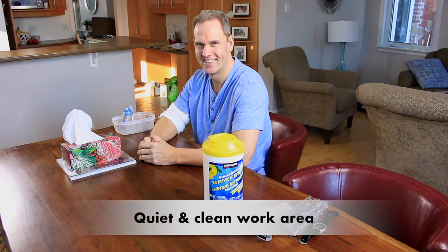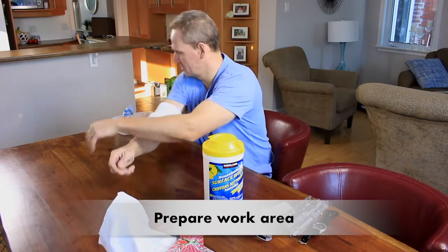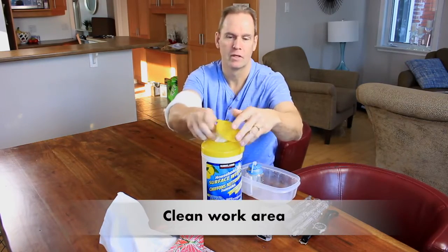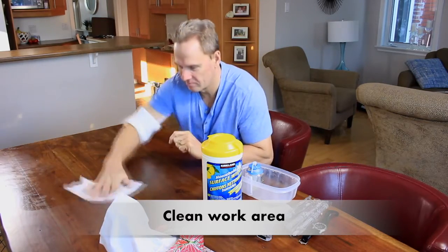You need to work in a clean, quiet area with plenty of room to work, so no dishes or books lying in the area. There should be no pets or children around, and no one should talk to you while you're doing your procedure or cough over the supplies you're working with. Kitchens and bathrooms are not good work areas because of the germs in these areas.